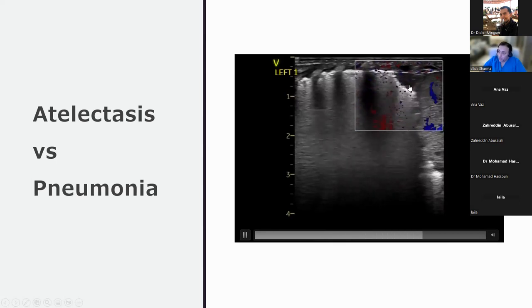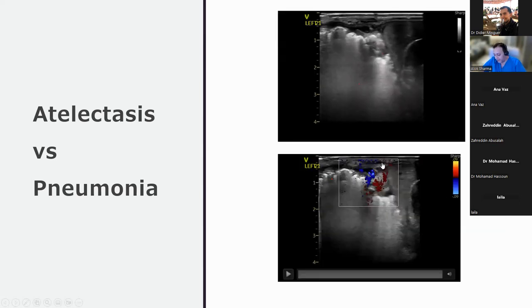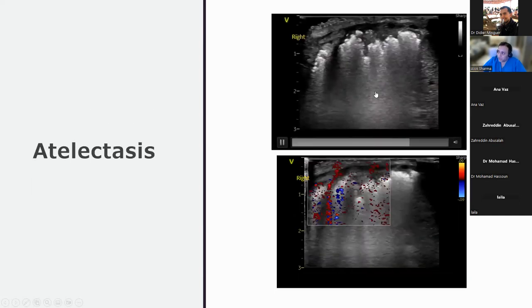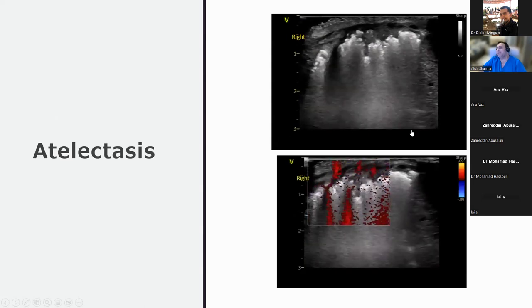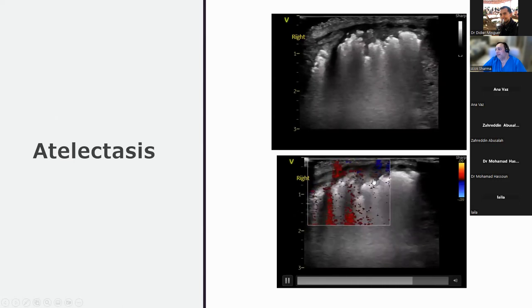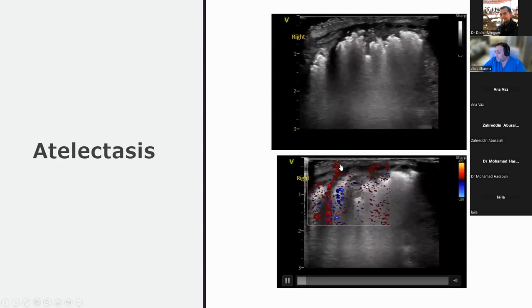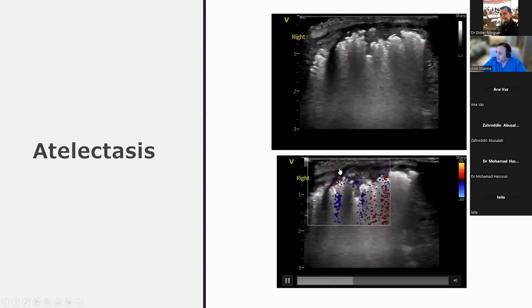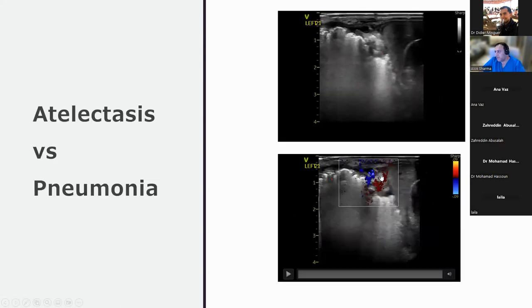So what I'm trying to highlight to you is it can be very difficult, even for the best of people, whether that's the experts. I'm sure it's as difficult for Nadia and Almedina. But in this area where you expect blood vessels, if this was a shred sign, I can't really see a blood vessel pattern. I just see a speckled appearance. There are some very dense areas over here. But again, this is outside the level of the lung. We're talking about the ribs over here. So this is the importance of using Doppler accurately.